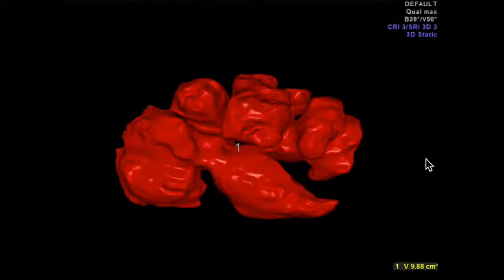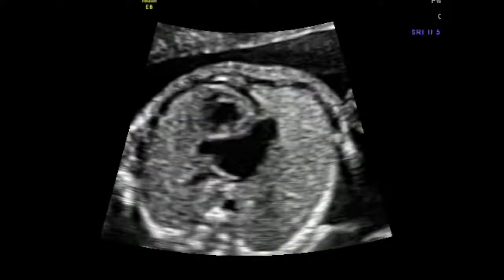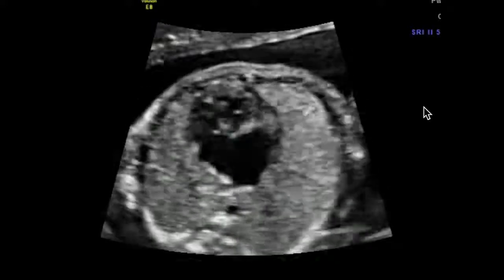So if you think of what you can do with cardiology that allows you to quickly model shape, this is a useful tool. So here's a case of mine from a few years back. If you look at the heart, clearly it's not normal. It's a case of tricuspid atresia, basically with a single ventricle. But if you look at the atrial appendages, you can see that they're a little atypical looking, particularly on the left side. And this was a case of right atrial isomerism.